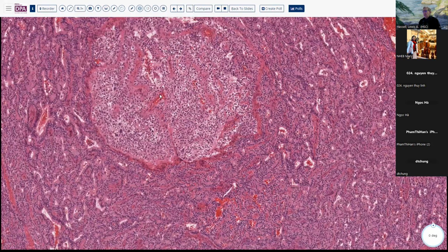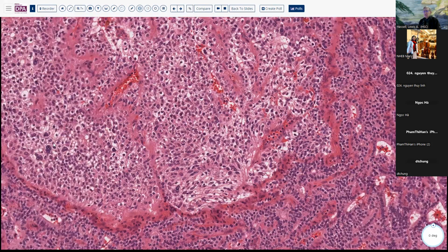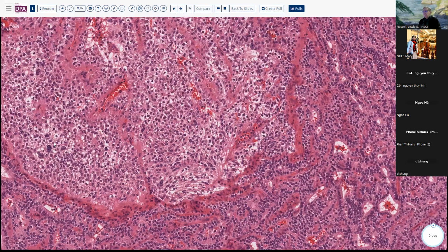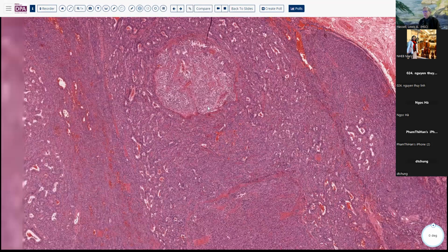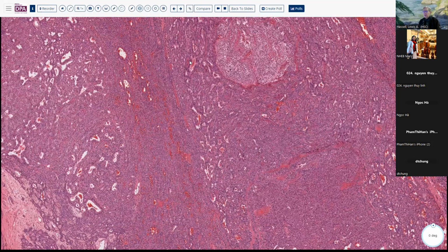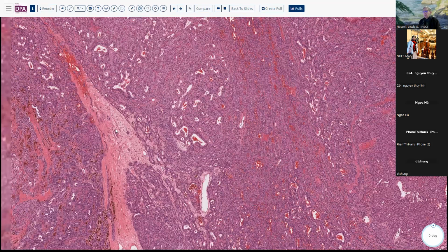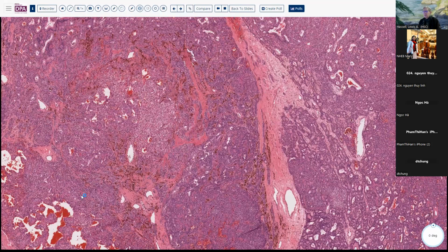As you see, we can get a degree of mild nuclear pleomorphism and different cell types. Here's more of the clear cell types or water clear cells that we see. And there are adenomas that are almost pure water clear cells. In fact, Dr. Zwan sent me one not too long ago that was predominantly water clear cells.